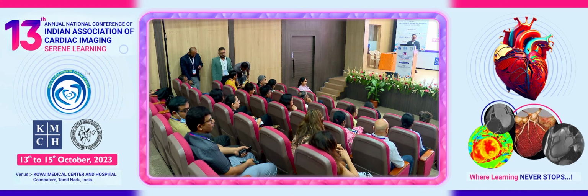Any other questions? I think there was a question on the app. A question is there by Vidushi Gupta from the first lecture. Should we label a patient as having regurgitation if we find regurgitation on Q flow but it is not seen as a jet on cine images? Yes, we should.